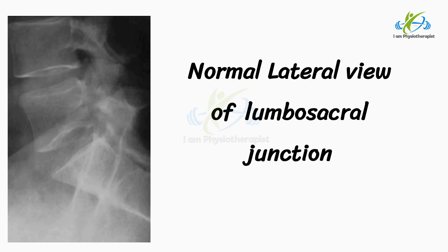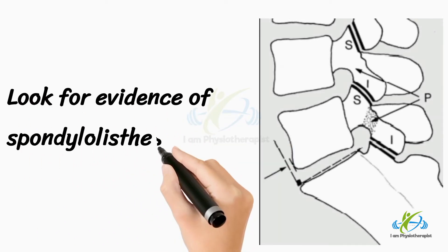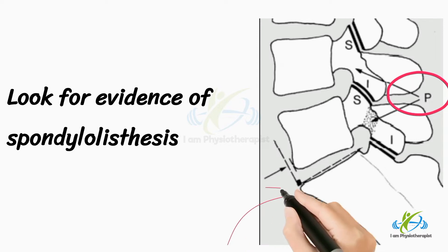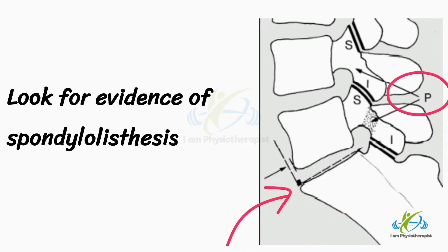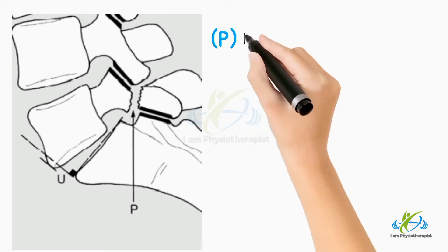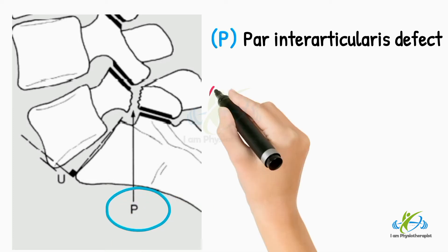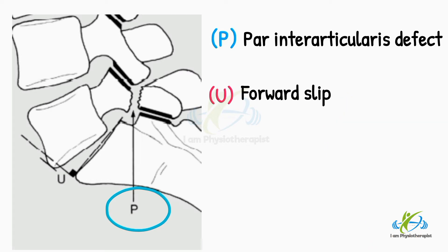Normal localized lateral view of the lumbosacral junction. Look for evidence of spondylolisthesis. In the normal spine, the pars interarticularis indicated by point P, lying between the superior and inferior articular facets, is intact, and a vertical raised from the anterior margin of the sacrum lies in front of L5. If spondylolisthesis is suspected, the lateral should always be taken with the patient standing. Note any defect as indicated by P, and any forward slip as indicated by point U.